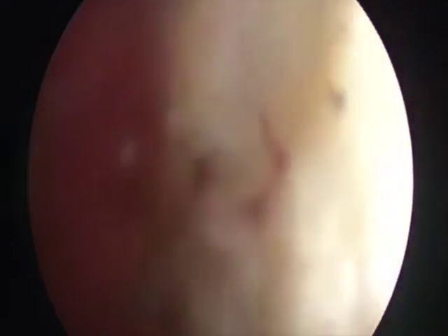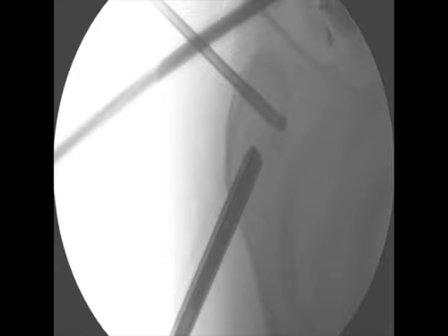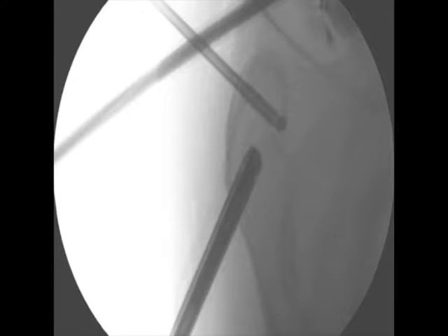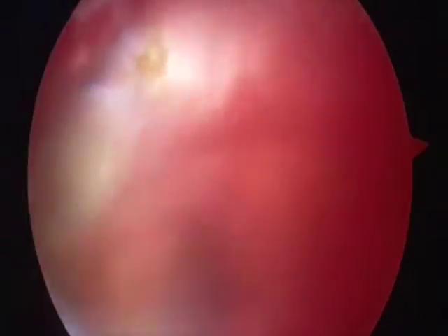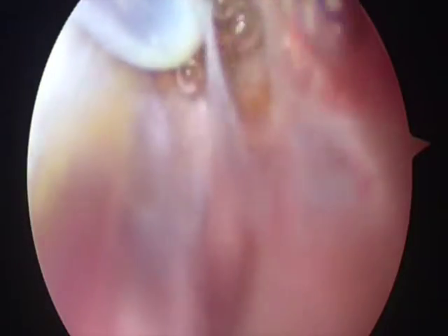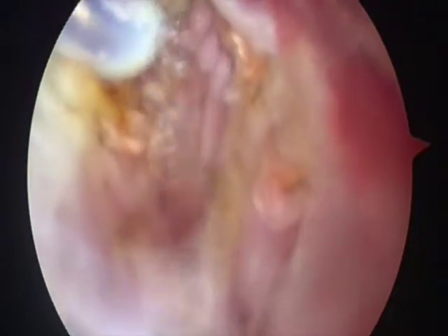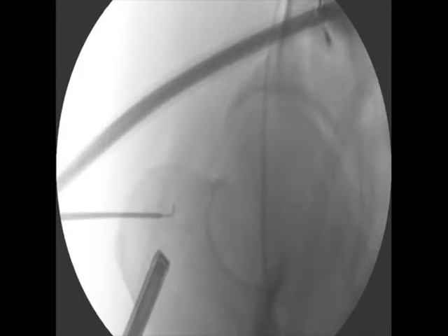The posterior superior corner of the greater trochanter is identified and dissected using a shaver and radiofrequency instruments. The position of these instruments is confirmed using fluoroscopy. A radiofrequency hook probe is used to release the piriformis tendon in a retrograde fashion, and its position can be confirmed using fluoroscopy.